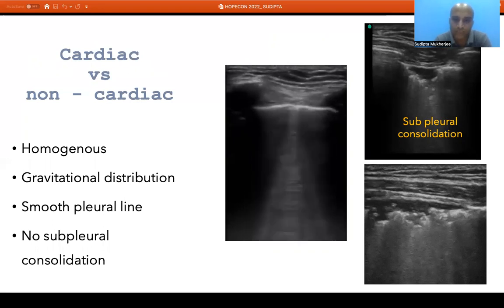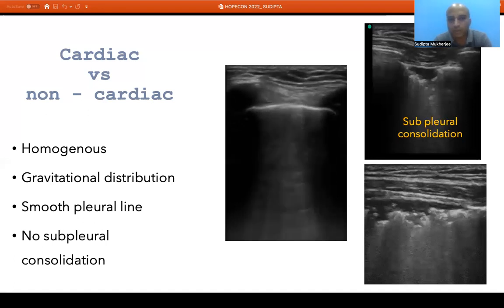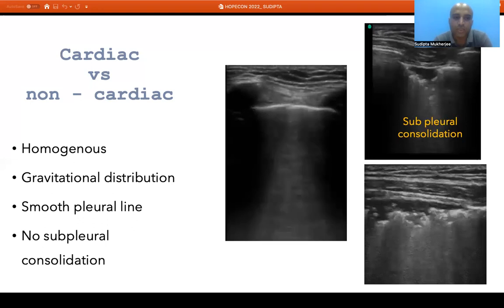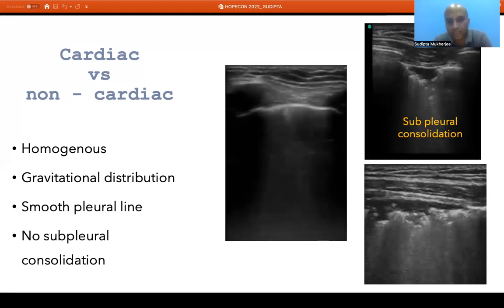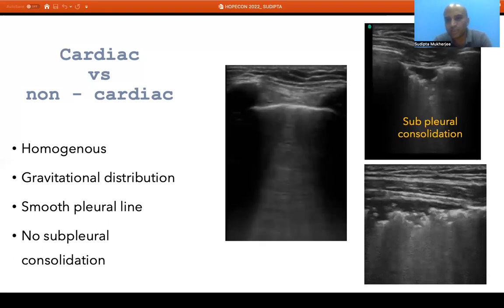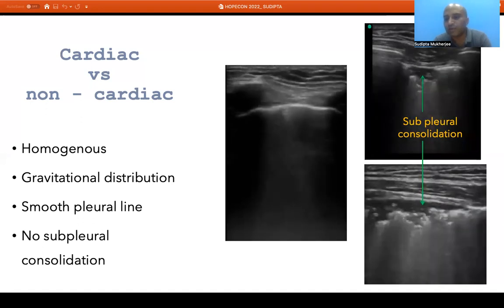We must differentiate cardiogenic pulmonary edema from non-cardiogenic pulmonary edema or ARDS. In cardiogenic pulmonary edema, both lungs are involved equivocally with homogeneous distribution, a gravitational pattern — fewer B lines anteriorly and more at the bases — a smooth pleural line, and no subpleural consolidation. On the other hand, if there is an underlying lung pathology such as ARDS, there will be subpleural consolidation, the pleural line will be broken, distribution of B lines will be non-homogeneous, and subpleural consolidation will be present.